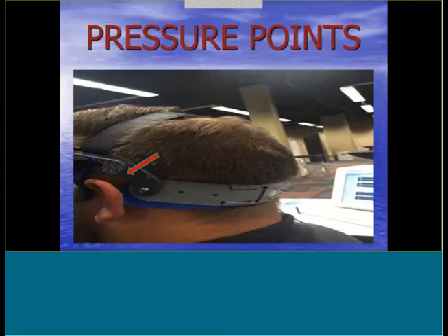Pressure points are very important, especially if you're in the operating room monitoring for up to 4 hours, say. Look where the ear is. See this plastic T-bar here, this little plastic serrated bar. Make sure the ear is not touching this area. We have our blue, I guess they're neoprene, little pads that we put on to protect the skin. If the ear is too close to this, just pull that little blue pad out and let it pad the ear. Or just use a piece of gauze. But always look for pressure points when you're putting this on.